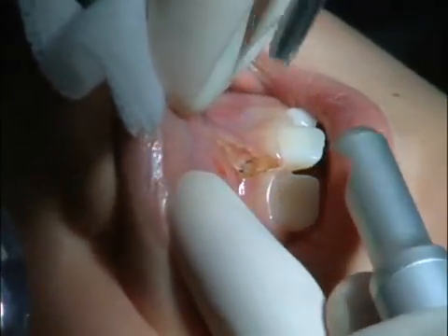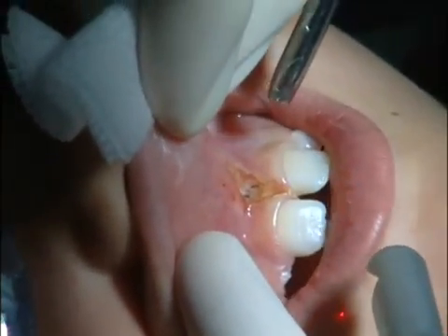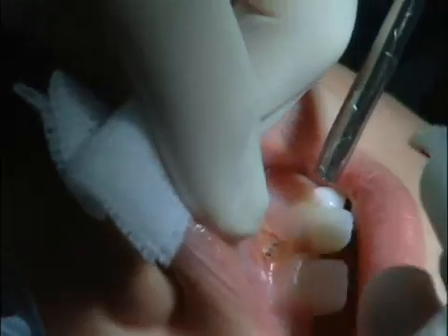If you'll notice there's a little black mark right in the center there — that's where we're down to the bone. So I took it all the way down.